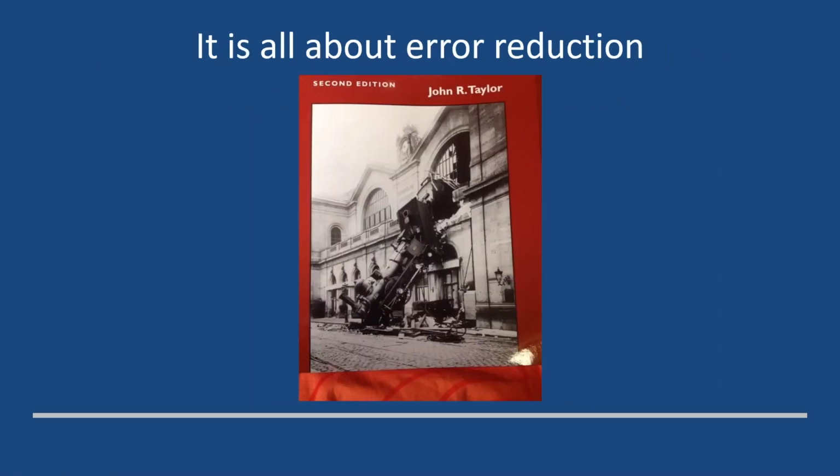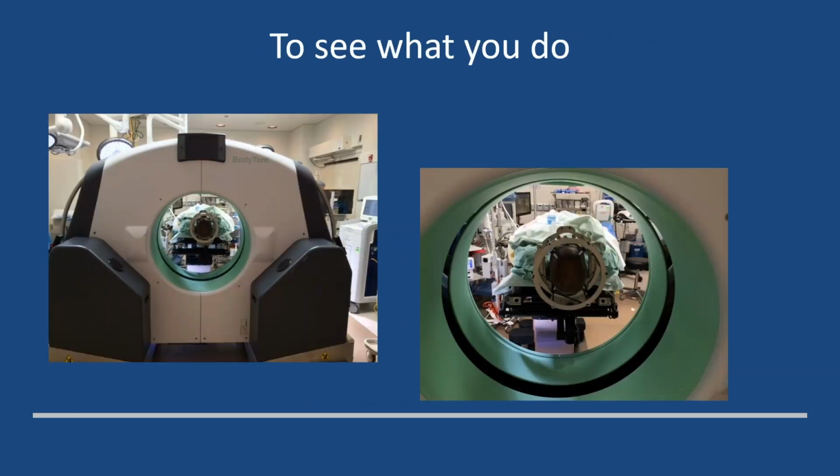And the philosophy is you want error reduction. You want to know when you do something that you're in the right spot, that you have implanted the right electrode, that you've resected the complete tumor, etc. And you can do this with a wide bore, even with the stereotactic frame, in this case the fiducials on, but you can have the stereotactic frame, the aiming bow on, whilst the electrode is in place, or the biopsy cannula, and take a quick scan. And then you look at it either directly, or what we mostly do is fuse it back to the planning MRI and see where exactly you are.